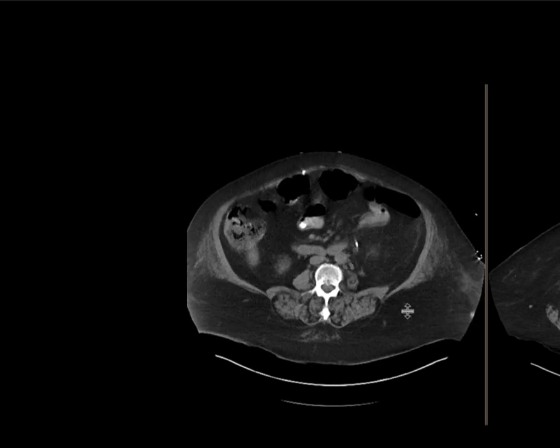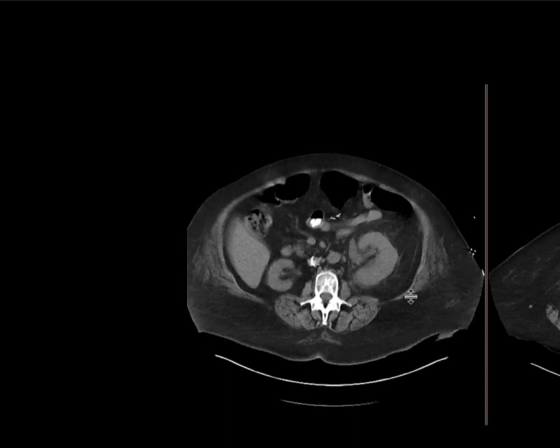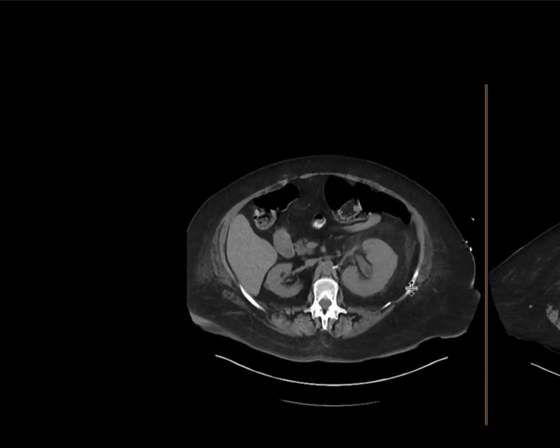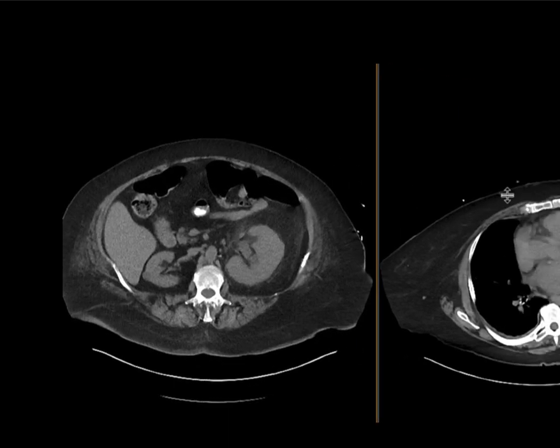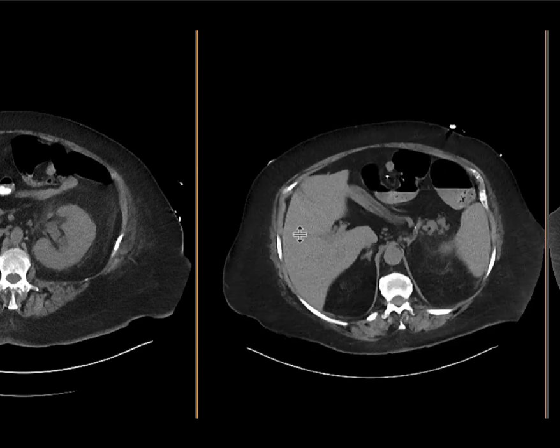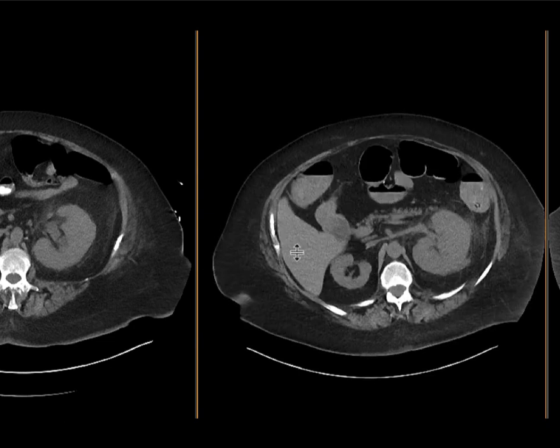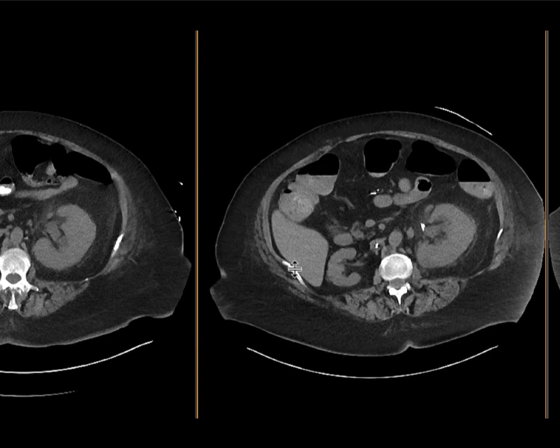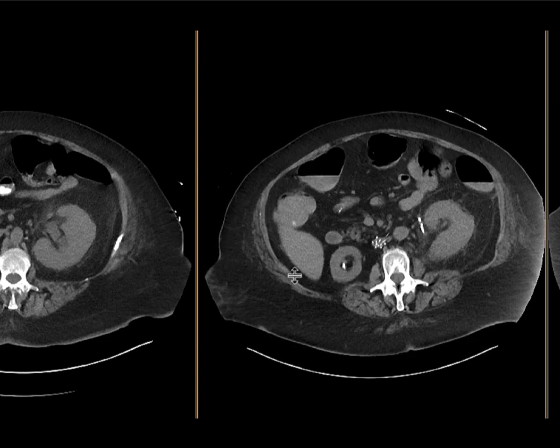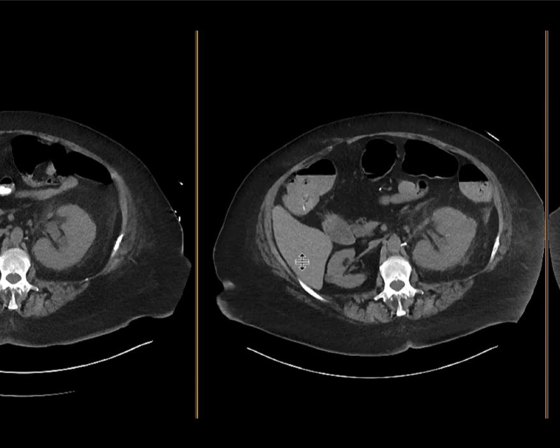The patient underwent ureteral stenting, the stone was removed, but had persistent pain. A repeat non-contrast study shows that the hydronephrosis has improved with the stent in place and the stone is no longer seen.